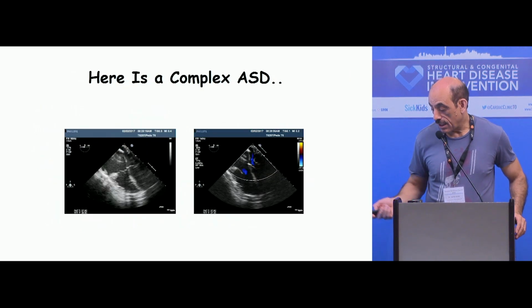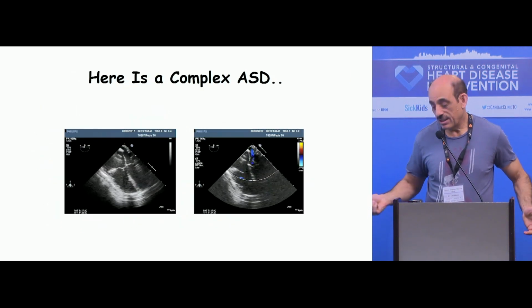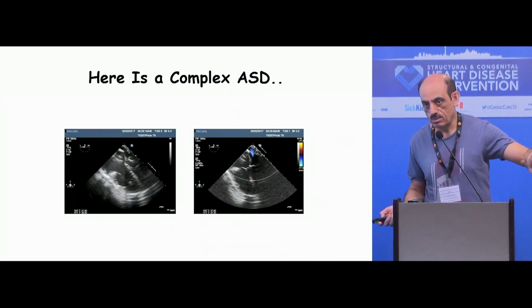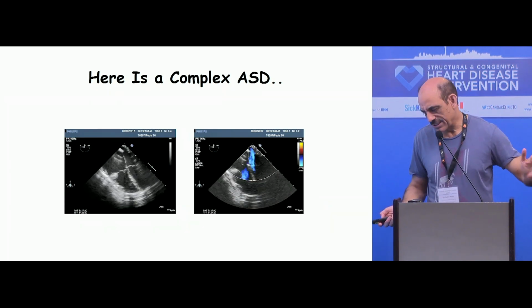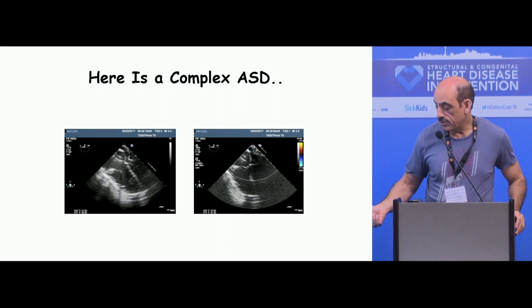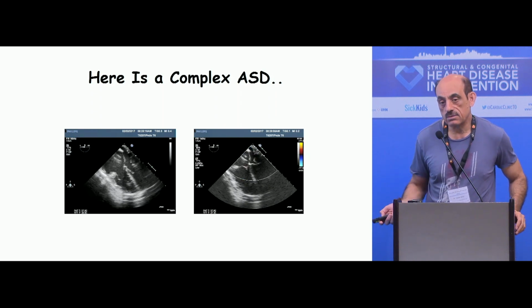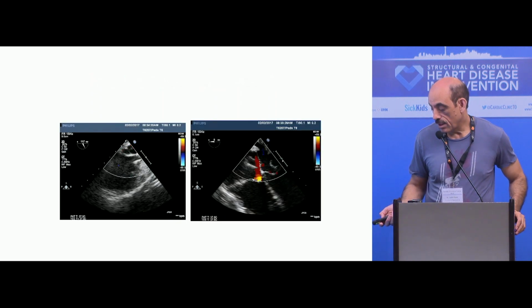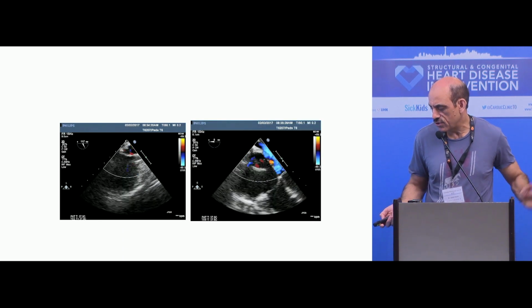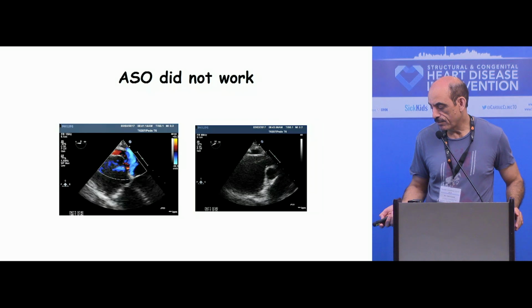So here's a complex atrial septal defect. If you look, this was a 16 millimeter ASD patient, weighed about 10 kilograms, so not a very small patient. We should be able to, I think, 16 or 15 ASD. 4-chamber view, transesophageal echo, and you can see some blood flow, which looks like pulmonary venous flow, right? This is a bicaval view. You hardly see the defect, which is a torrential amount of flow to the left atrium.